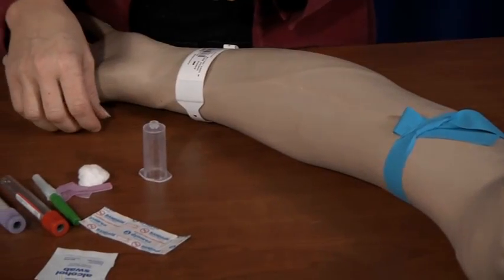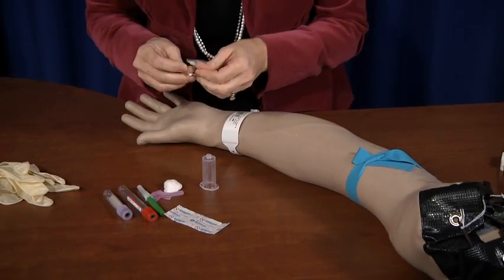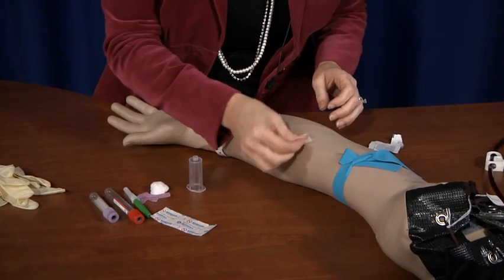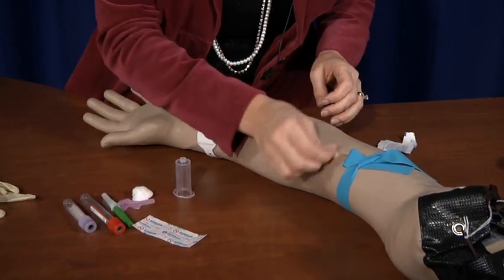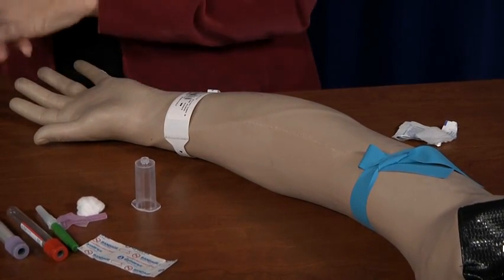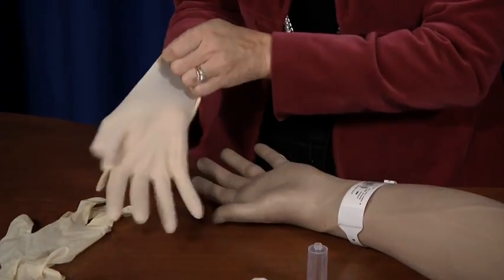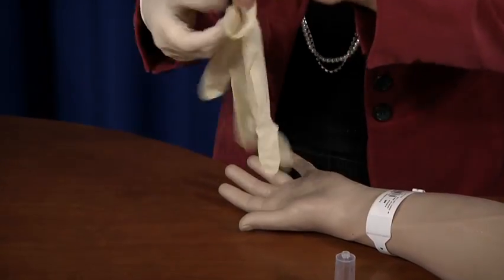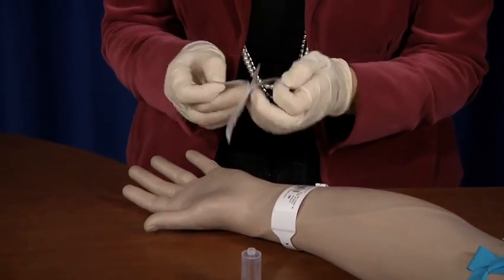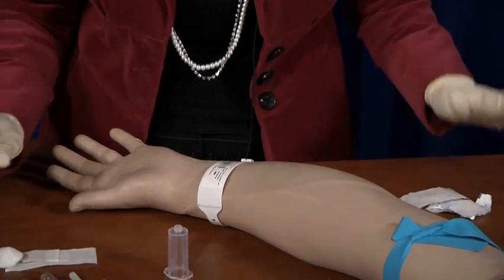So once we've determined which one we're going to use, we're going to need something to clean it with. We're going to use alcohol. Take your alcohol and in a circular motion, clean the area, about 2 inches out. Now we've already washed our hands or used hand sanitizer, so I'm going to put my gloves on. And I like to go ahead and get my Band-Aid ready. Got a Band-Aid for the end and a little cotton ball.